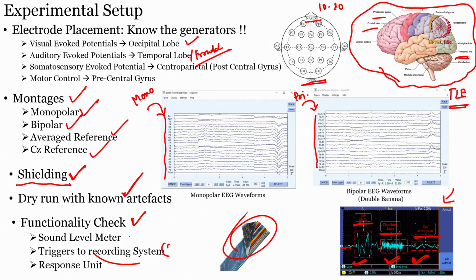Okay, and if you are going for an auditory experiment, there are guidelines to present a certain amount of sound. Especially if you are working with neonates or newborns, you can't simply give any intensity or any kind of sound and present it, right? There should be a limit considering the anatomy of that particular newborn baby. The same goes for elderly subjects as well.